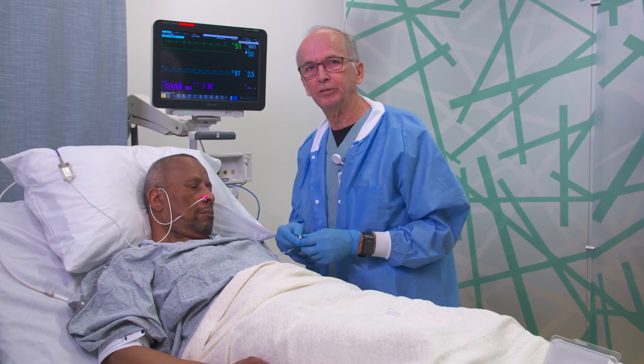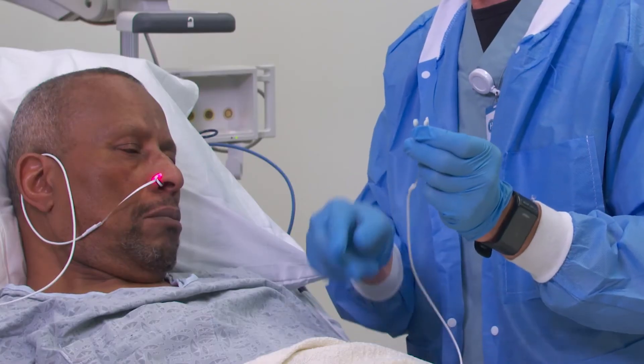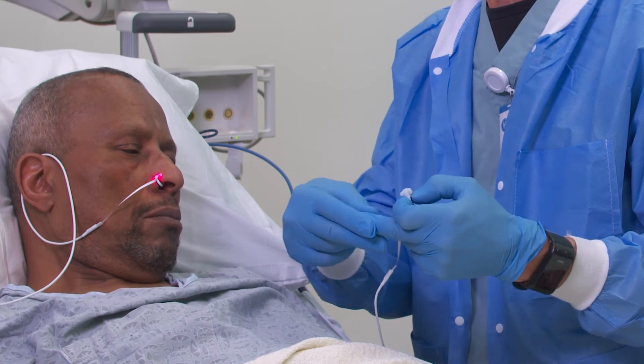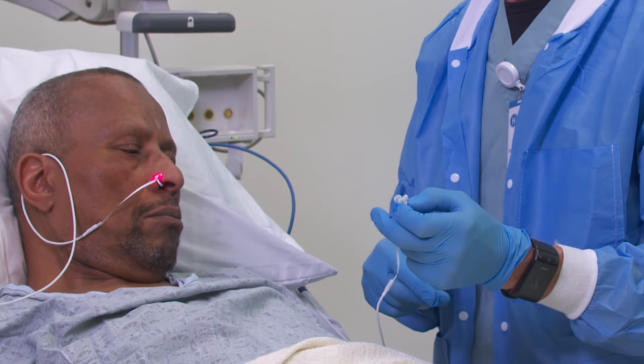Unlike a disposable finger sensor, you also have predictable orientation between the light emitters and the light detector, whereas with the finger you have to think about aligning these things and you are navigating fingernails and different digit sizes.